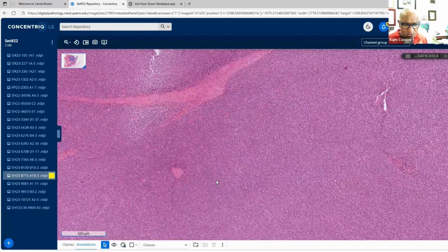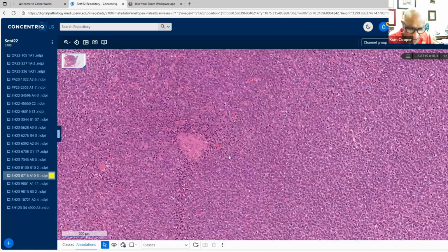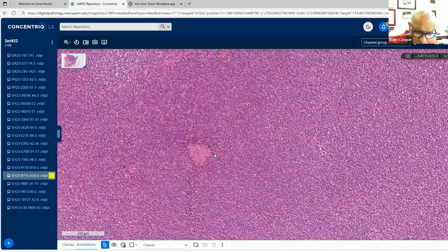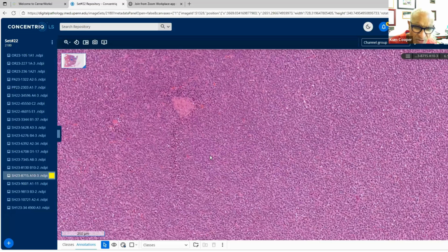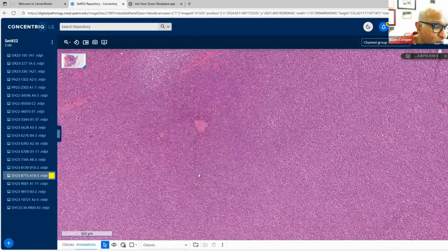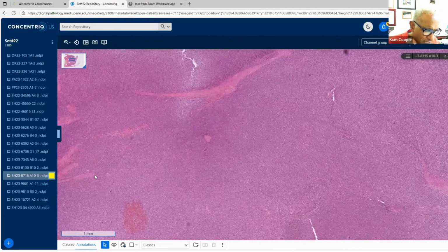Actin is positive in them. You can get some desmin positive, and they do have some interesting molecular analyses. I can never remember whether it's NOTCH or PITCH, but I've not resorted to that to make a diagnosis of glomus tumor. But that's a good thought. That's a good thought. So the myeloid markers are negative.